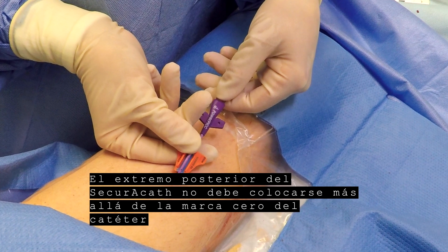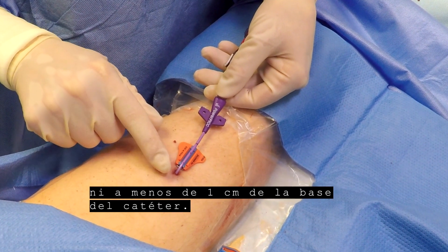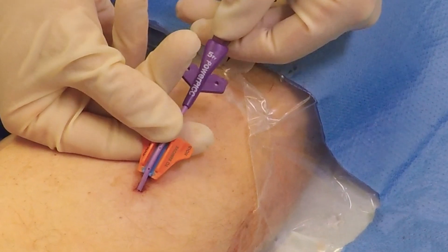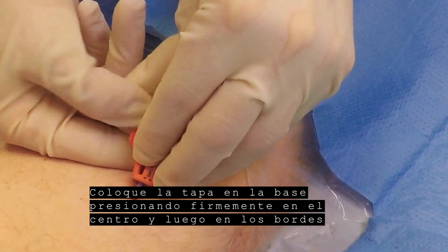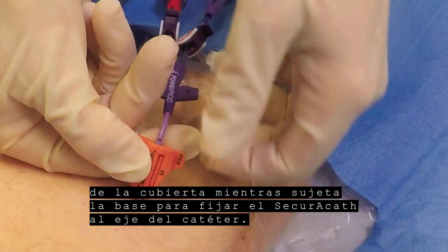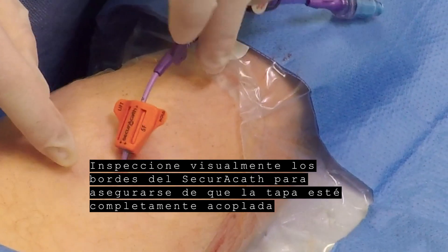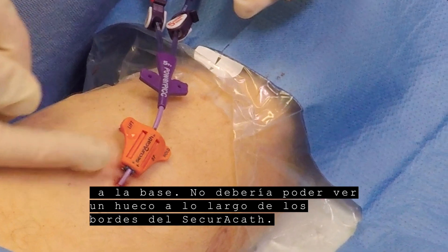The back end of the SecuraCath should not be placed beyond the zero mark on the catheter or closer than 1 cm from the catheter hub. Press the catheter into the groove. Place the cover on the base by pressing firmly on the center and then on the edges of the cover while holding the base to affix the SecuraCath to the catheter shaft. Visually inspect the edges of the SecuraCath to make sure the cover is fully engaged with the base — you should not be able to see gaps along the edges.